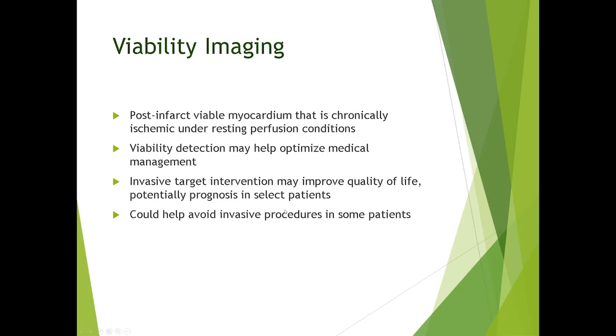Now moving on to viability imaging. So what is viability imaging? Viability imaging is post-heart infarct visualization of myocardium that is chronically ischemic under resting perfusion conditions. Why we want to detect this is because we want to help optimize medical management for these patients.